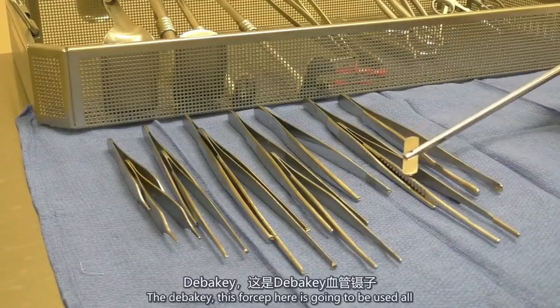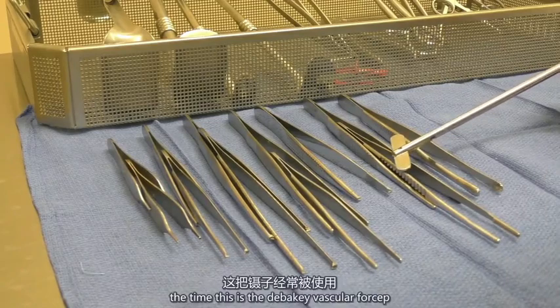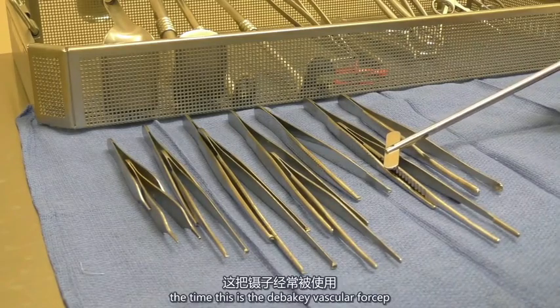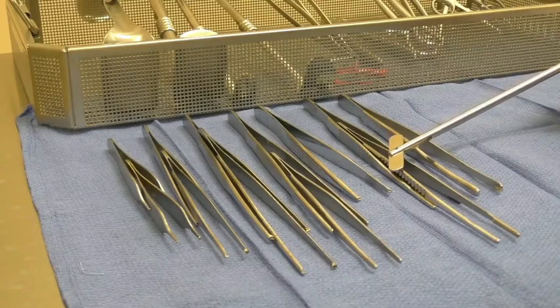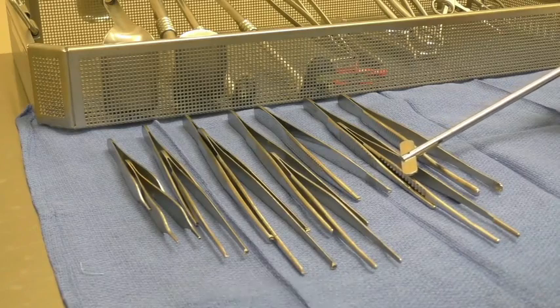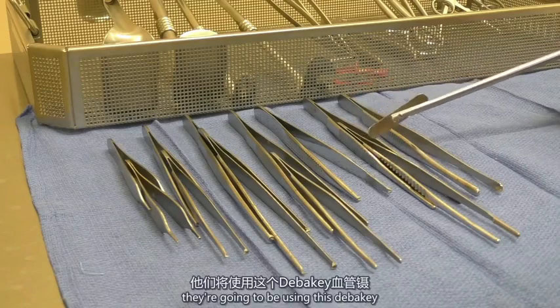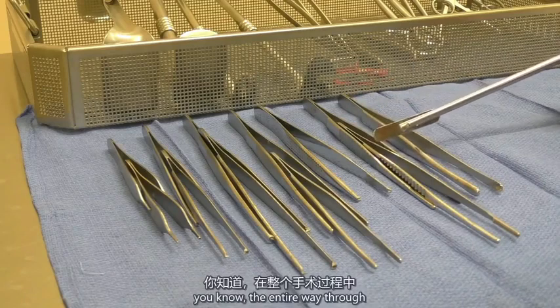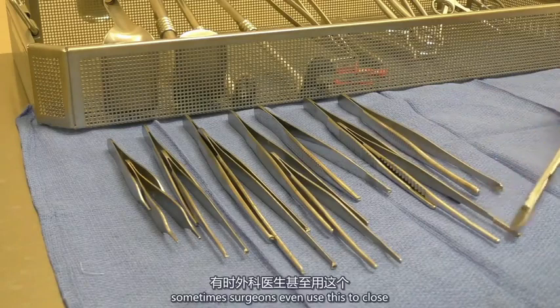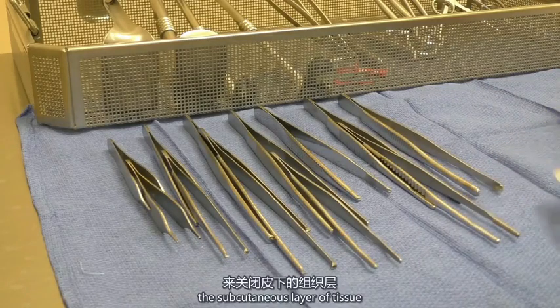The DeBakey, this forceps here is going to be used all the time. This is the DeBakey vascular forceps, and it's used, I mean, basically as soon as the incision is made and they're bovieing down to, you know, where they need to fix the problem, they're going to be using this DeBakey, you know, the entire way through. Sometimes surgeons even use this to close the subcutaneous layer of tissue.